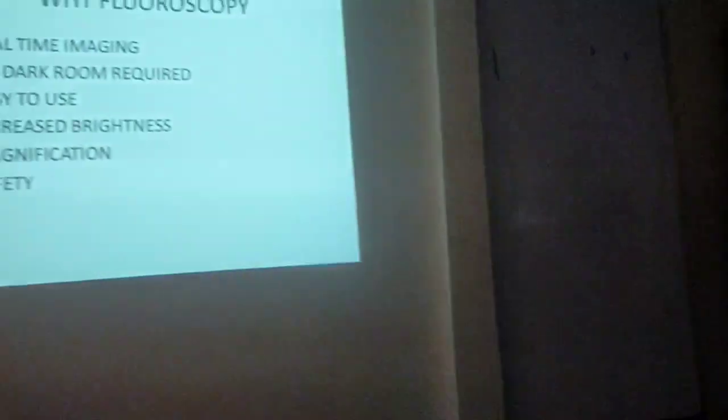Introduction: it is always better to remember the scientist who gave us X-rays. Konrad Röntgen discovered the X-ray in 1895 and was awarded the inaugural Nobel Prize in Physics in 1901. What is fluoroscopy? Fluoroscopy is a type of medical imaging that shows continuous X-ray images on a monitor.